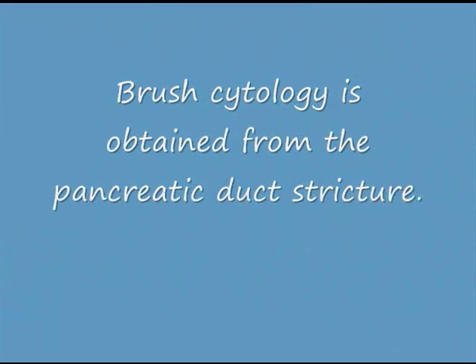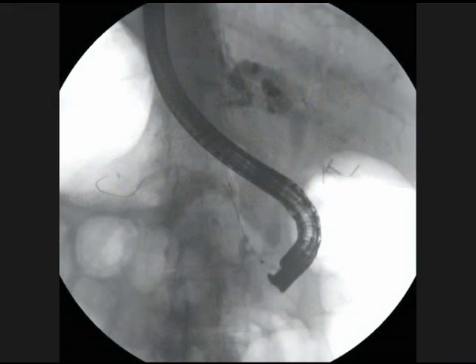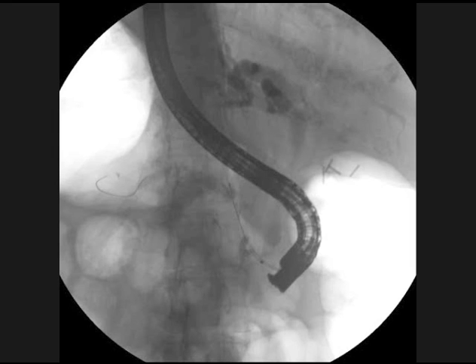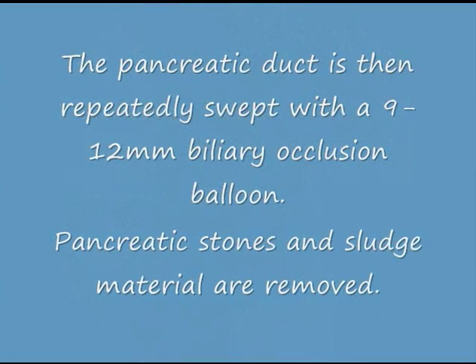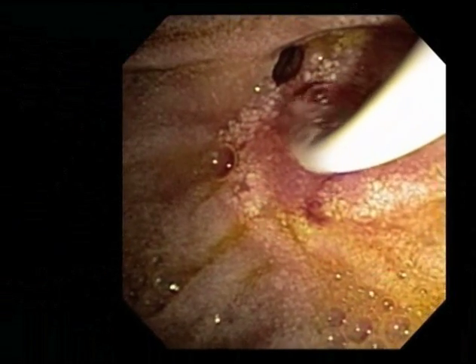Brush cytology is obtained from the pancreatic duct stricture using a biliary brush. The pancreatic duct is then repeatedly swept with a 9–12 millimeter biliary occlusion balloon, removing significant pancreatic stones and sludge.